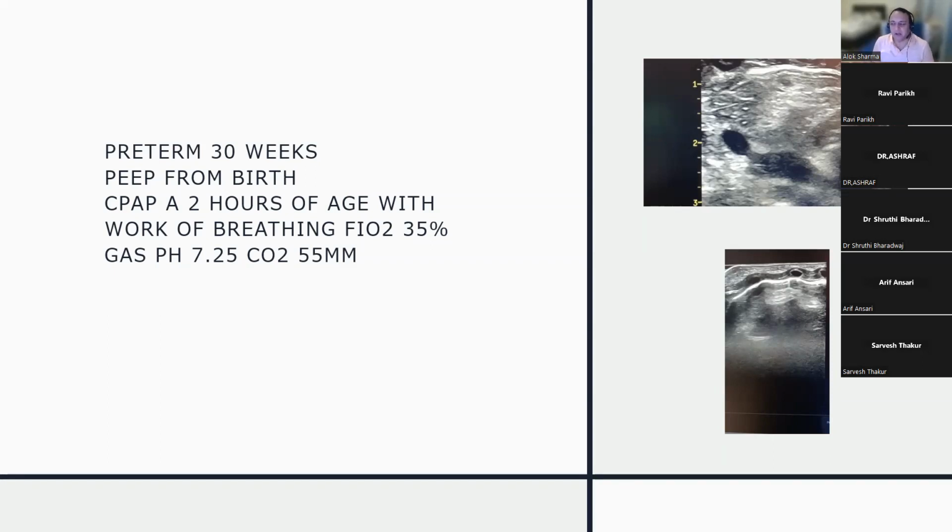Now, at this particular point, 30 weeks IUGR, no risk factors for sepsis. Certainly no preterm passage of meconium in this particular situation, but a baby who came out vigorous with normal cord gases, so not perinatally compromised, but with significant work of breathing, and is currently on quite high PEEP setting. So we're using a PEEP of 7. We have a high CO2 on the gas.